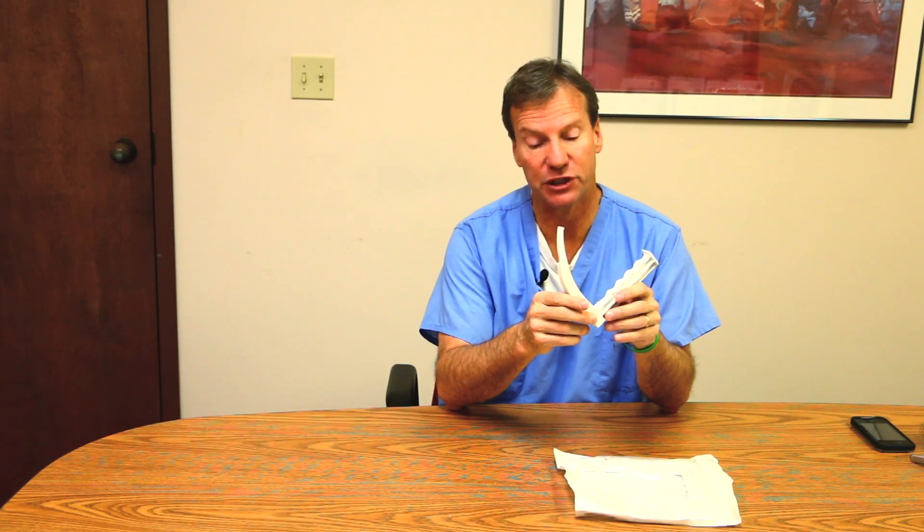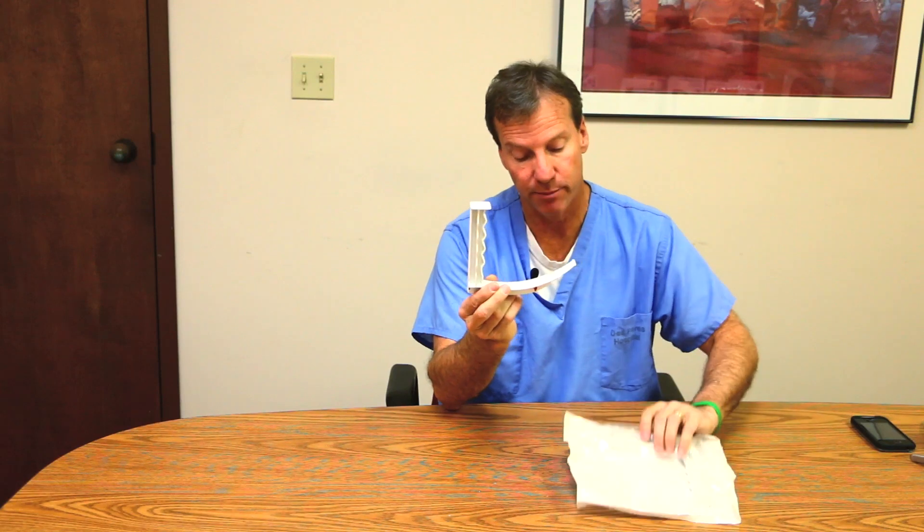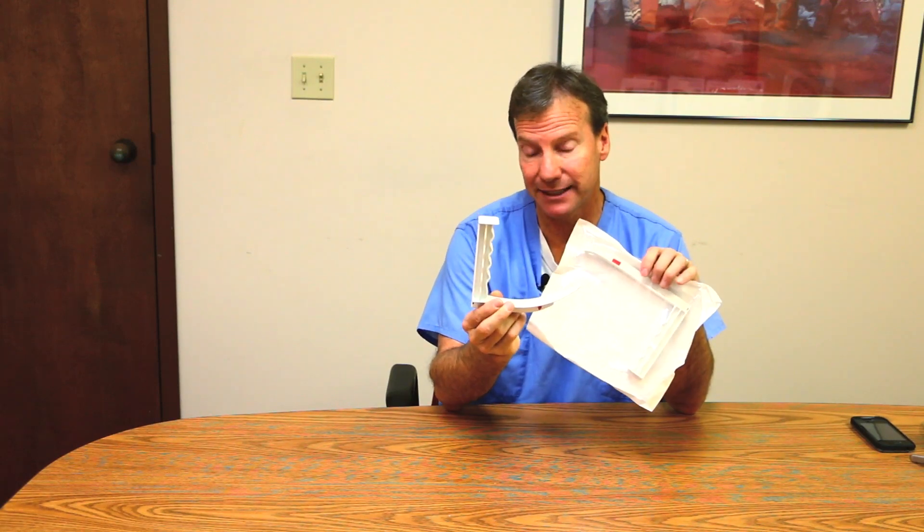This is an exciting new market development. We have a disposable laryngoscope blade and handle combination that has an impressive light source to it. It is a device that is all one piece, and it comes packaged in either Miller or Mac sizes.